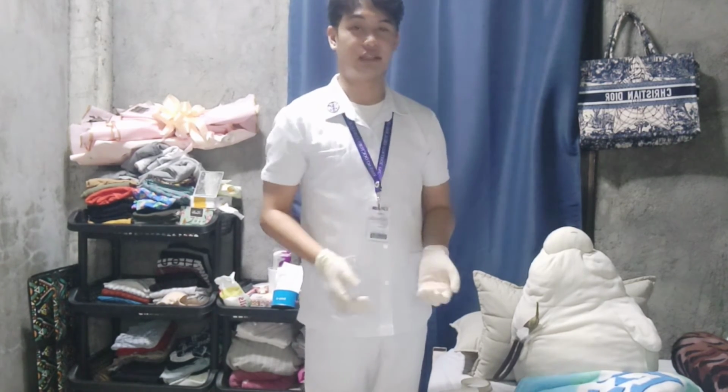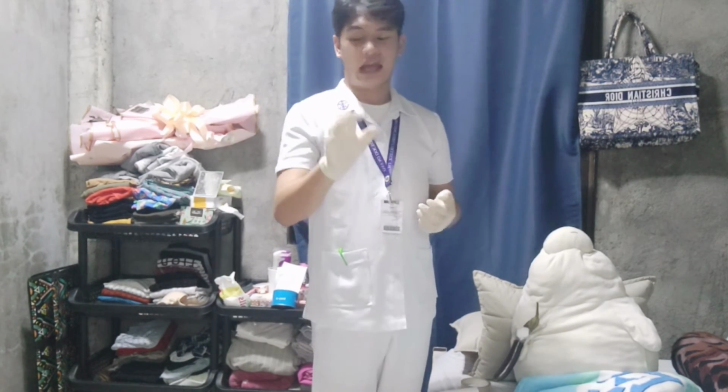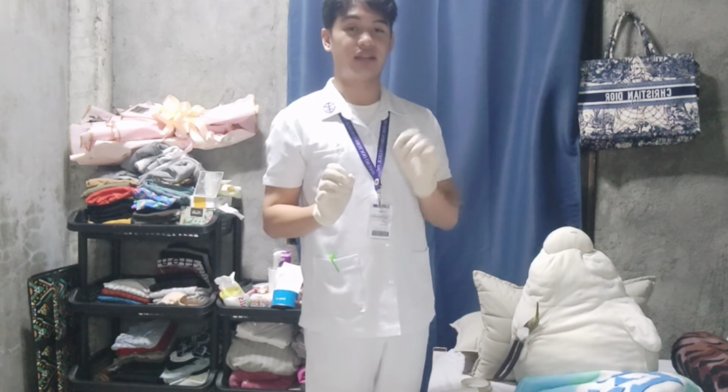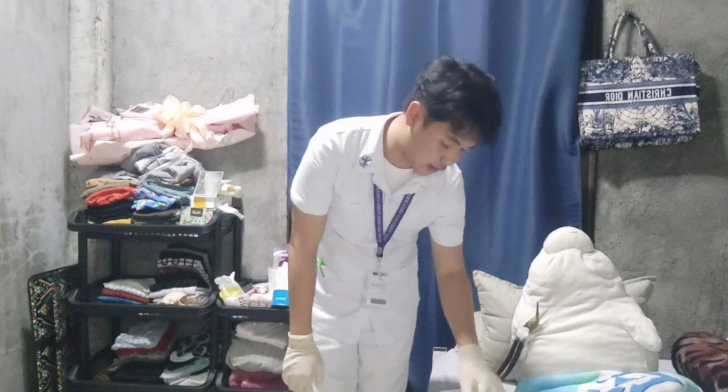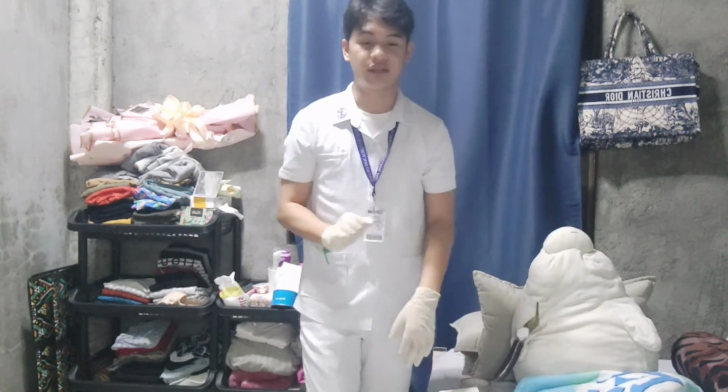Next, we need to activate the needle safety device or discard the uncapped needle and attach the syringe into the proper waste receptacle. Proper receptacles are used to prevent others from being pricked by the needle. We are going to discard the syringe into the proper receptacle. So I've discarded already the syringe. Remove and discard gloves and perform hand hygiene again.